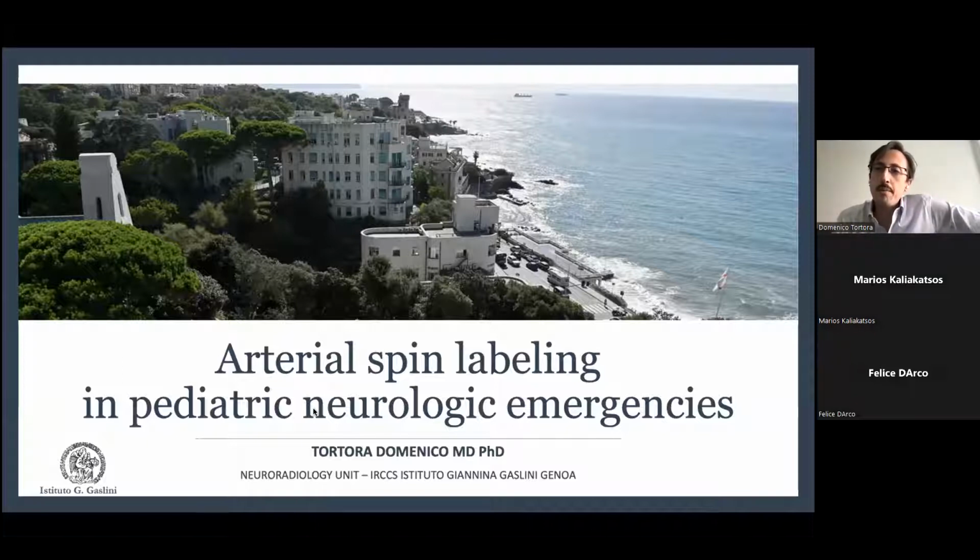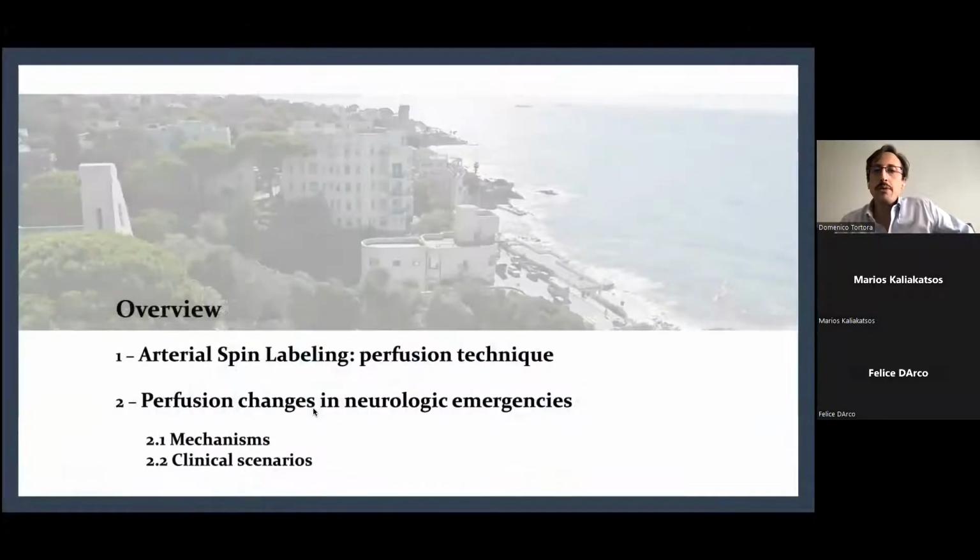This is probably one of the most useful advanced MR techniques in clinical practice. In this presentation, I will show some clinical applications for evaluating pediatric neurologic emergencies. I decided to divide this presentation into two main parts.